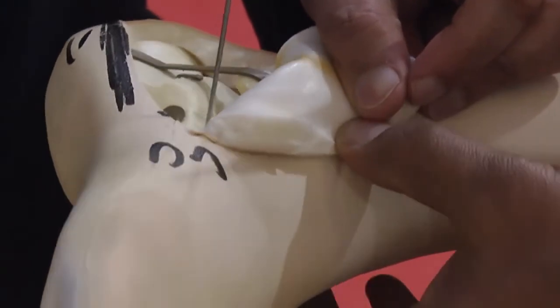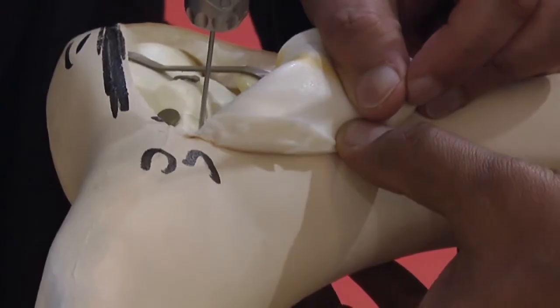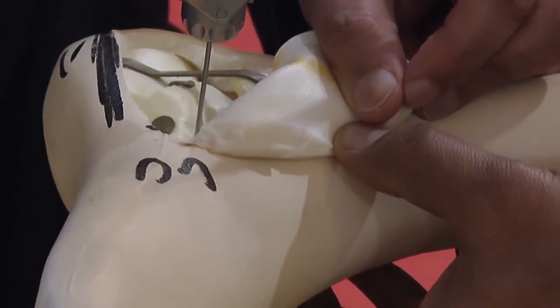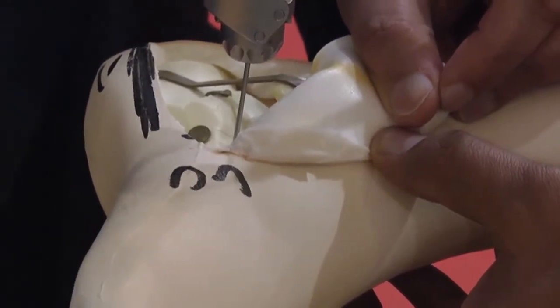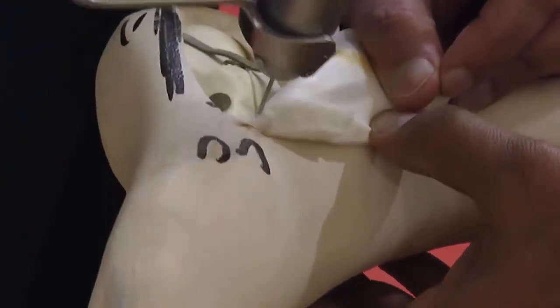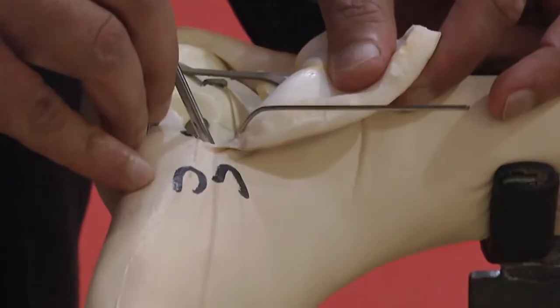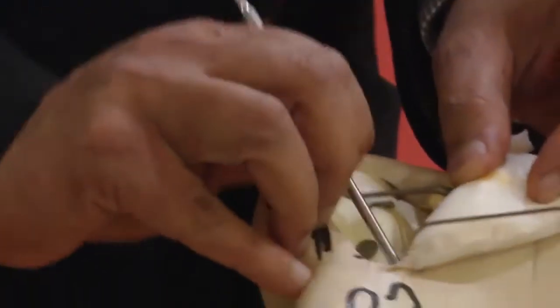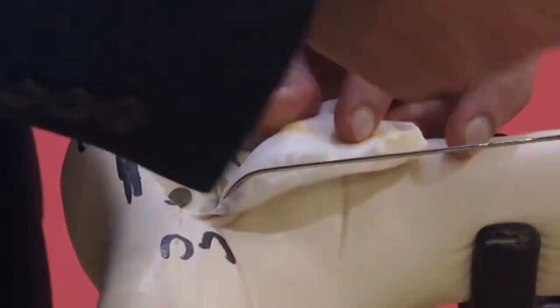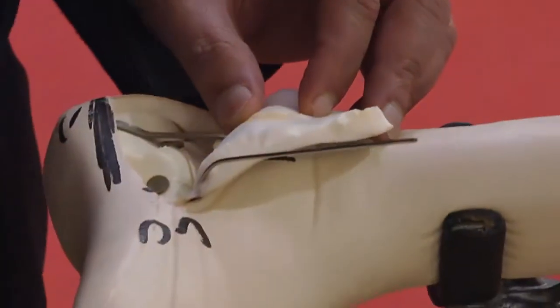That is an angle where the peroneal tendons are prone to injury, because the peroneus longus curves around the cuboid. So once you are dissecting this part of the flap, you have to be doubly sure that the tendon has been retracted, and your wire goes under the tendon and then lifts off the tendon, so that the wire is retracting the flap and the tendons with the flap.